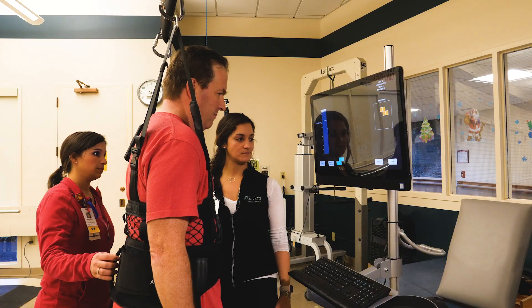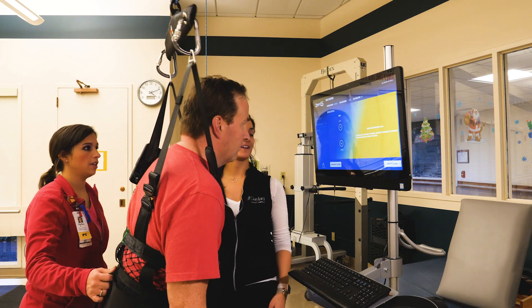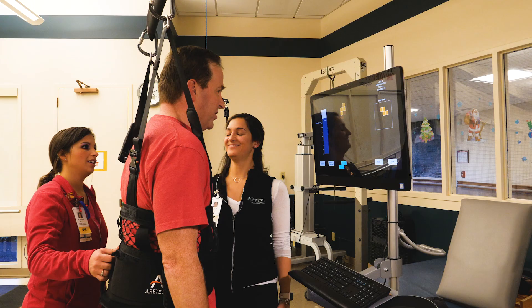We can do lunges, squats — this allows us to be hands-off with our patients so we don't have to be holding on to them as much. They can really get a sense of independence without that fear of falling because the system will catch them if they do lose their balance. For gait training, it allows us to have one therapist instead of needing two hands-on for a patient, so it gives more therapy time to patients throughout the day.